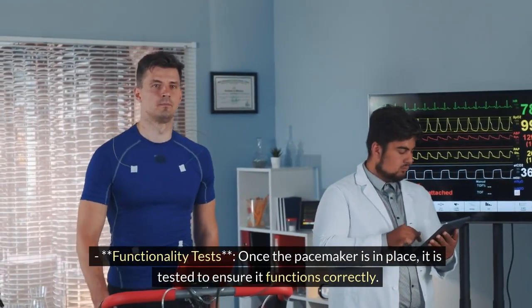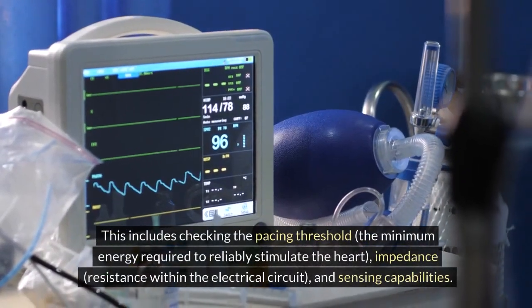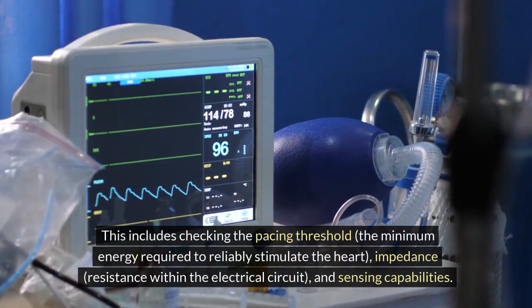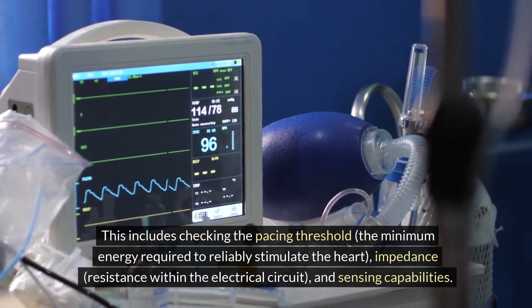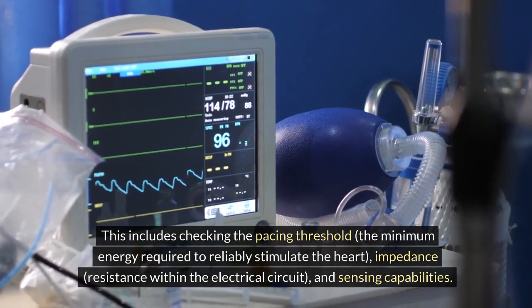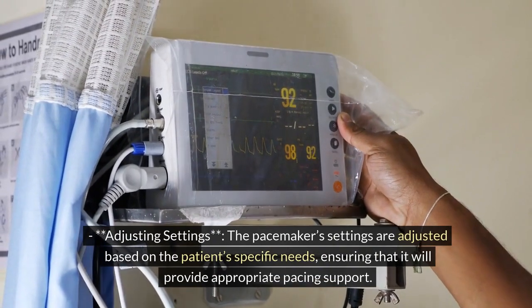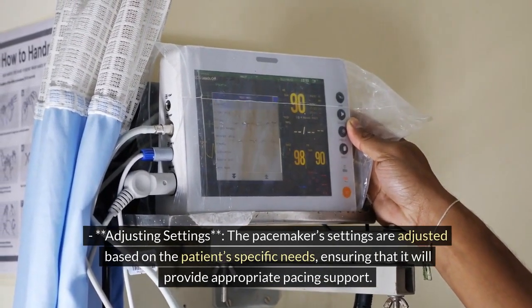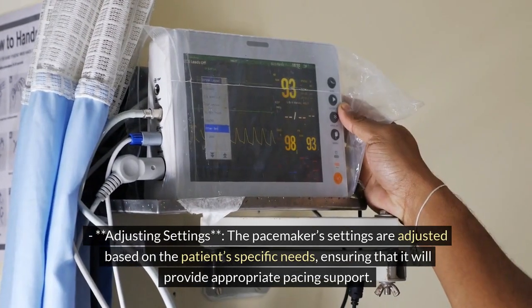Step 4: Testing and adjustment. Functionality tests: once the pacemaker is in place, it is tested to ensure it functions correctly. This includes checking the pacing threshold — the minimum energy required to reliably stimulate the heart — impedance, which is resistance within the electrical circuit, and sensing capabilities. Adjusting settings: the pacemaker settings are adjusted based on the patient's specific needs.